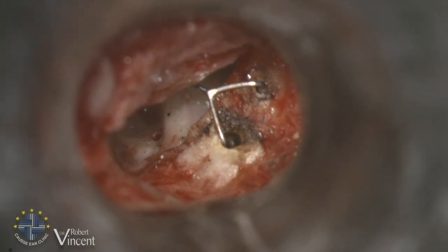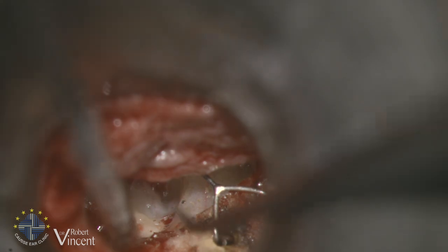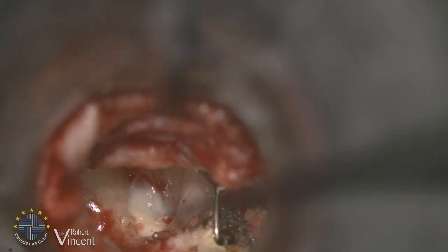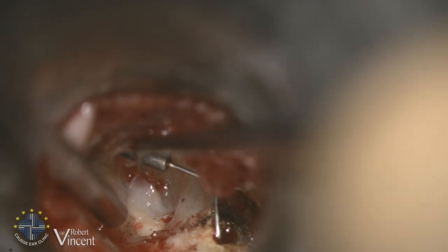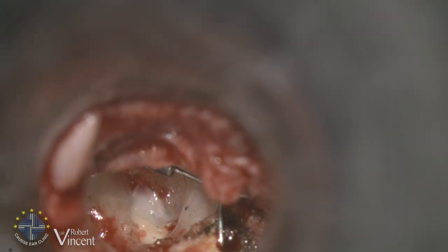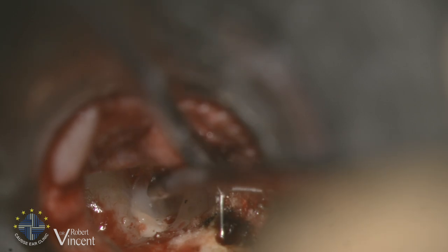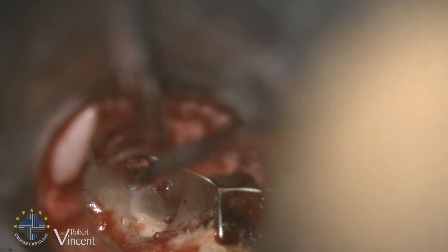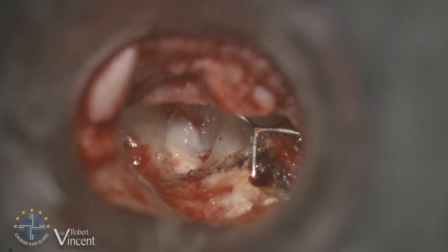Now it's fine, and you can see I can place the malleus handle over the footplate like this. It would be fine if I place it a little bit more posterior. I hold the hook and change the position like this. Now we have a nice new malleus handle. What I also like to do is to lateralize the malleus handle a little bit, because I have to take into account that we have a lateralized tympanic membrane. I can adapt that during the second stage.